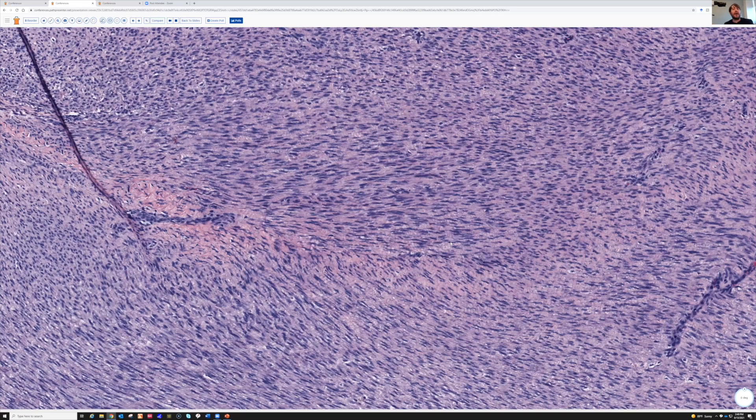I would say almost every case of desmoid fibromatosis I see has occasional mitoses — I mean, it has to grow somehow. But people get very worked up and worried about that. I've seen many cases where people have sent in consult and said, well, I think it's fibromatosis, but there's mitoses present — and that's okay.